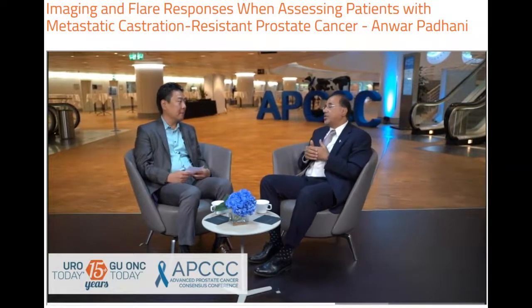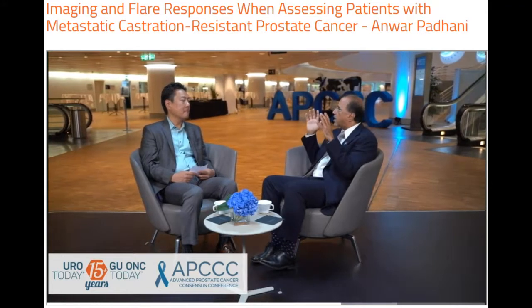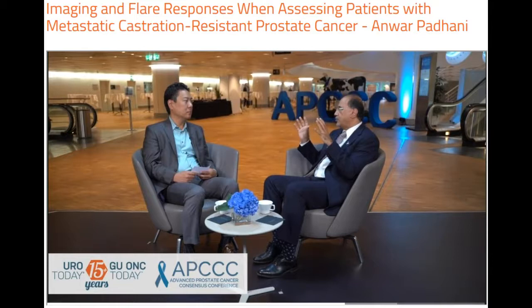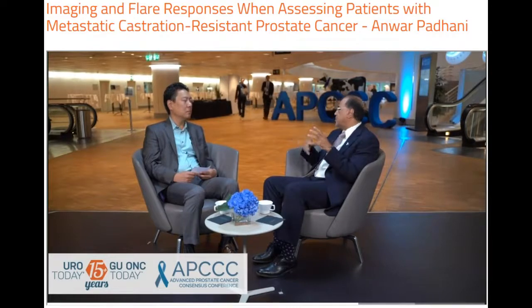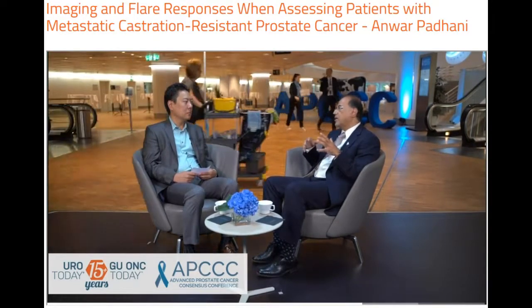Correct. So I think there's a role for all of these technologies. Now, the PET technologies, no doubt, they are highly sensitive. So they tend to be quite useful for the detection part of the disease, and their high sensitivity makes them very useful for that purpose. So if you have clinical trials in the early space, the development of metastatic disease, when you want to detect early metastatic disease, then those technologies make sense.